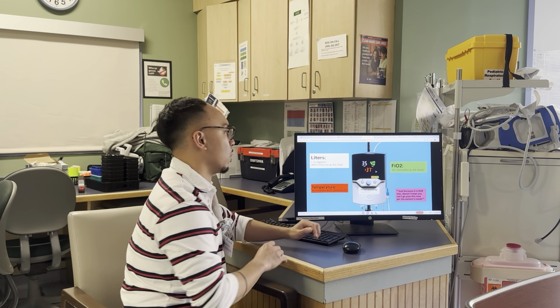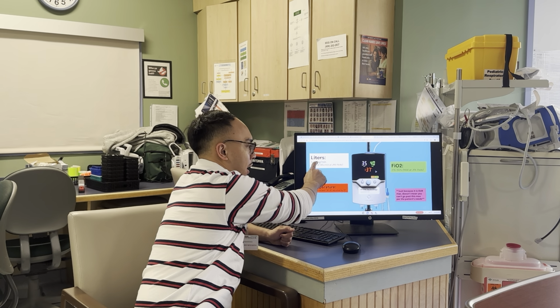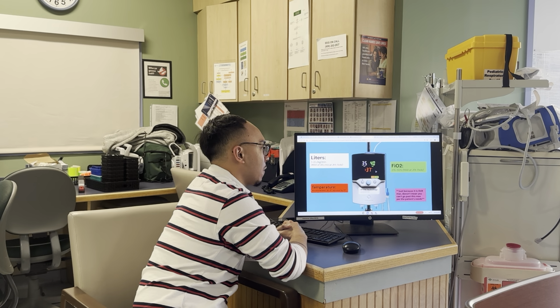You didn't have that? No problem. So we'll go over in detail. There's 3 numbers on the high flow system. One, you're looking at the white number, which is the liters. At JFK, you can go from 1 to 2, right? Starting 1 to 1.5, maxing at 2.